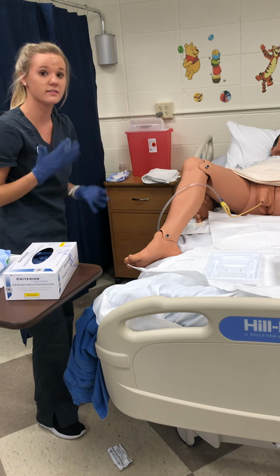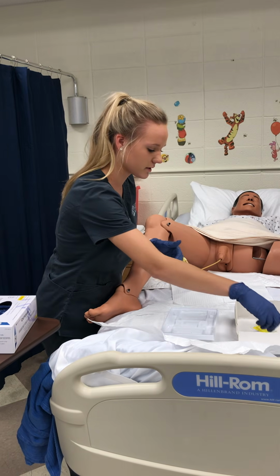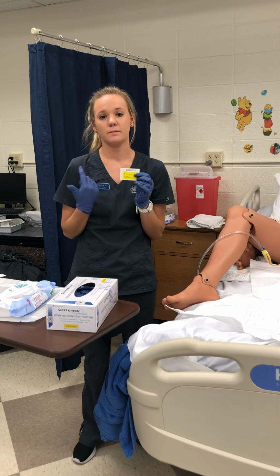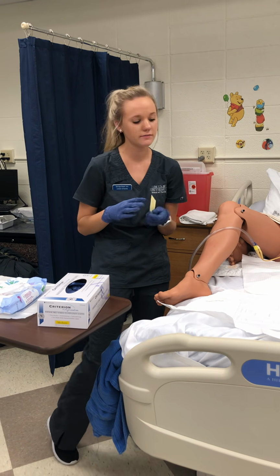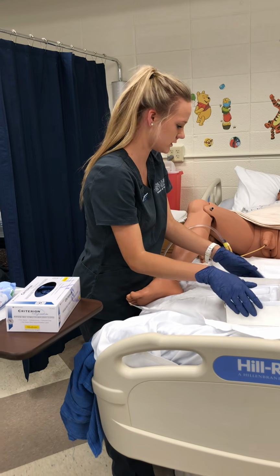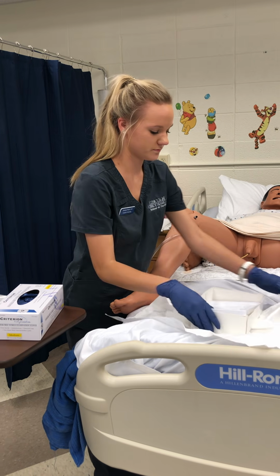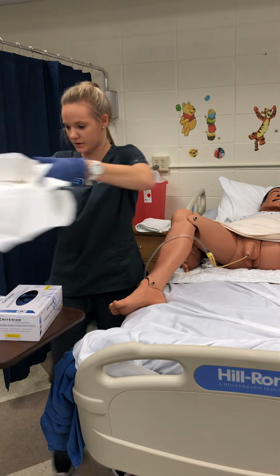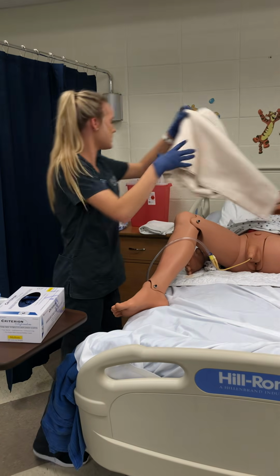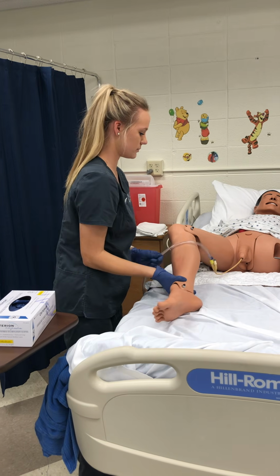And like I said, I'd assess the amount and color and characteristics. I would take my little tag here and I would do the date and time of the insertion and my initials. I'm going to clean all of this up. And I would throw this away. I put this in the dirty linens. Make sure my patient's in a comfortable position.